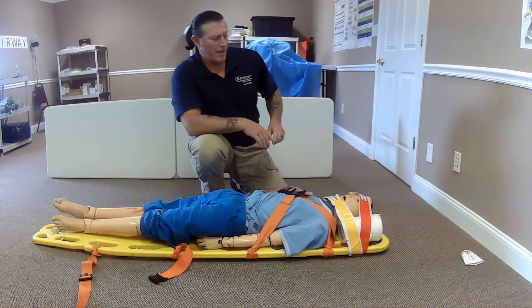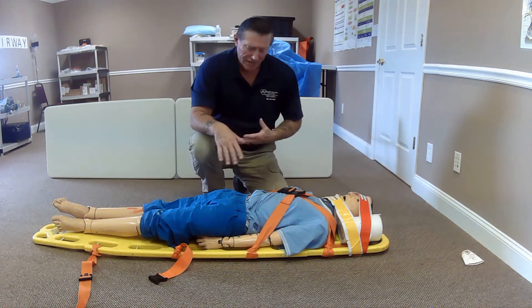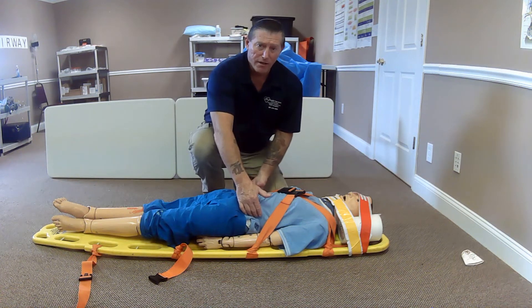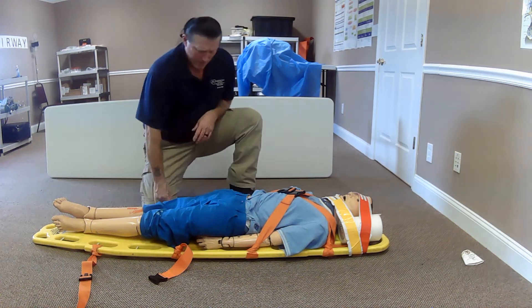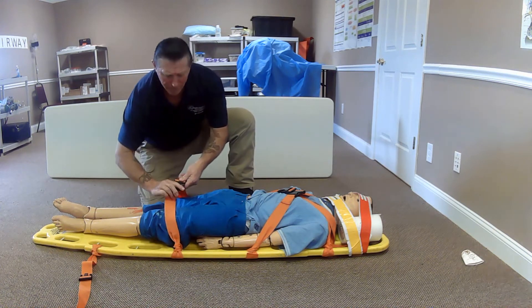My patient's head is now secure and the torso is secure. If I need to, I will also pad any voids under the back, the lower back area, and underneath the knees if needed. I will now finish strapping my patient to the device, coming across with my legs.